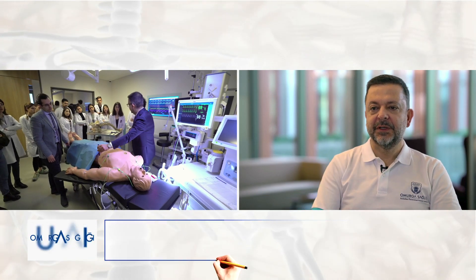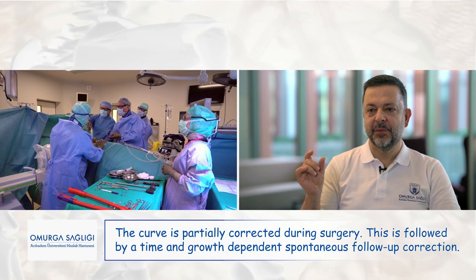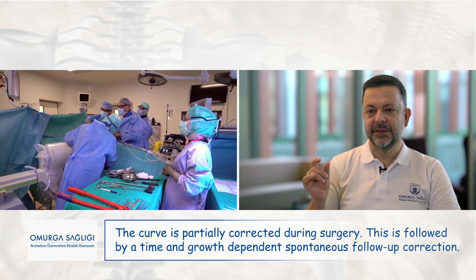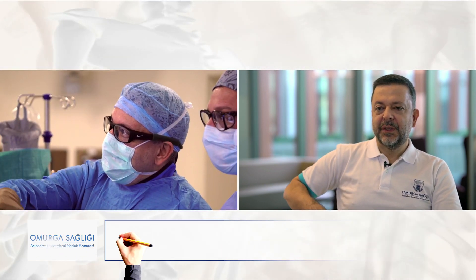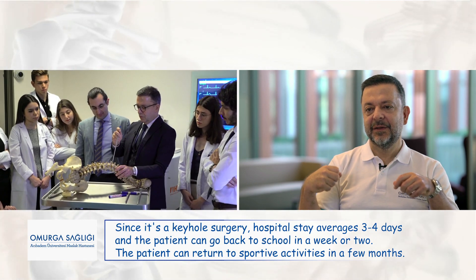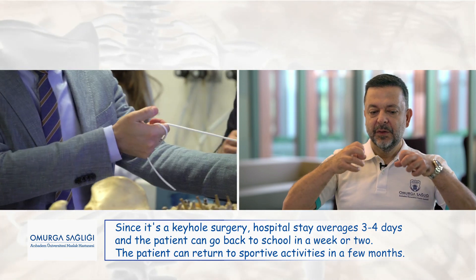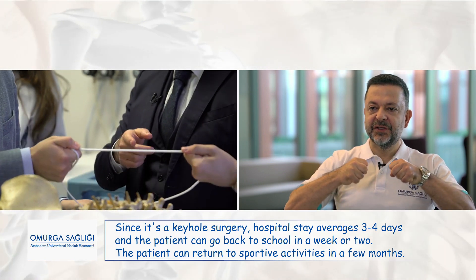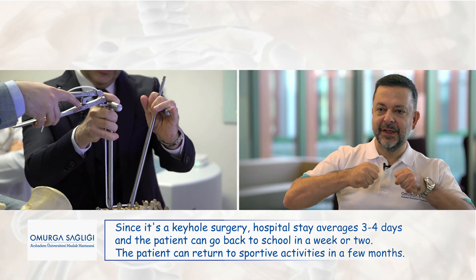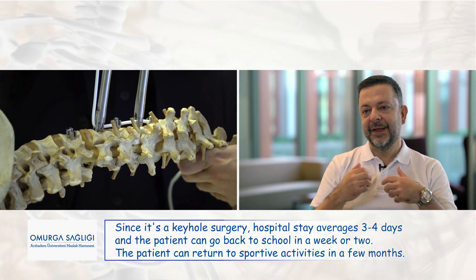The incisions used for this technique are on the side of the body. We generally make six small incisions between one and three centimeters. Smaller incisions are used to introduce the camera and thoracoscopic tools, while the larger incisions are used for instrumentation and correction. Using the ports, screws are placed on the convexity of the curvature. Then the tether is placed on the tulips of each screw. Tensioning the tether achieves some deformity correction. Before tensioning, we use reducers to apply corrective and derotational forces, and we tension the tether in this position to achieve the desired correction.